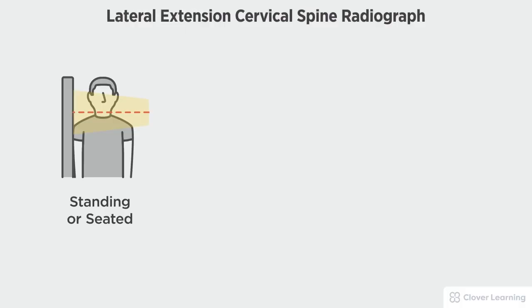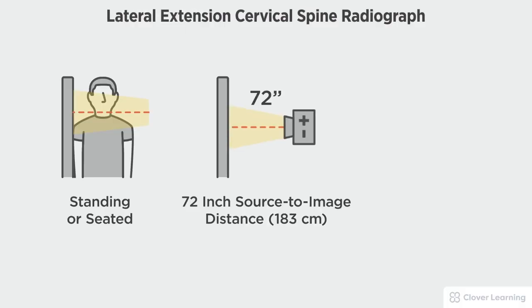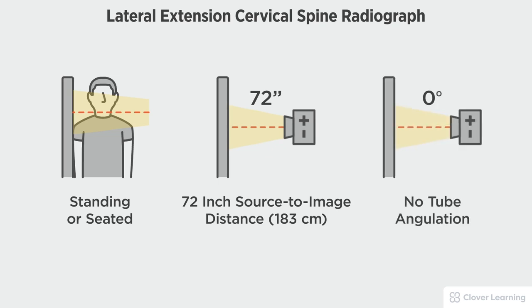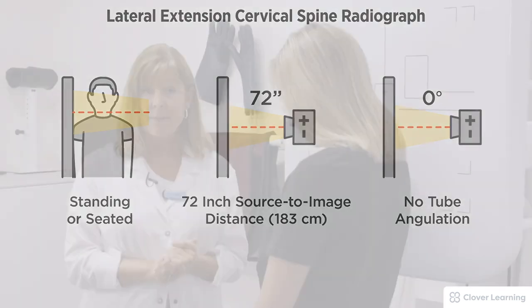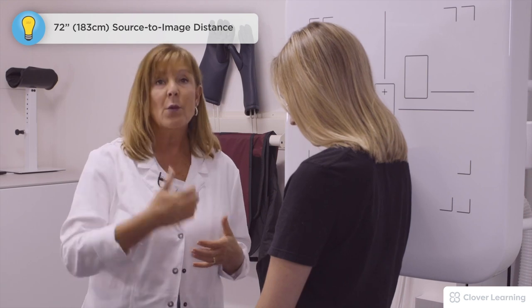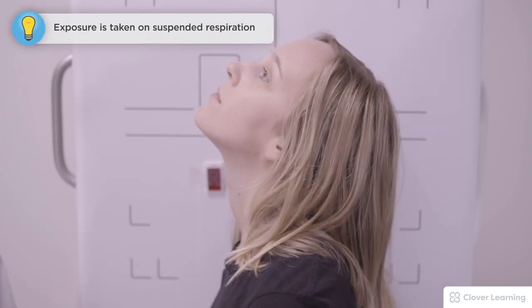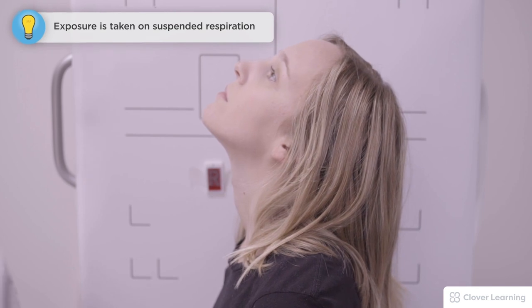In this view we will be demonstrating the lateral extension cervical spine. The lateral extension cervical spine should be performed with the patient standing or seated at the upright Bucky, a 72-inch source to image distance, and no tube angulation. When we lift the chin all the way up for extension, it closes those spaces — for extension, she's going to raise her chin to the ceiling.